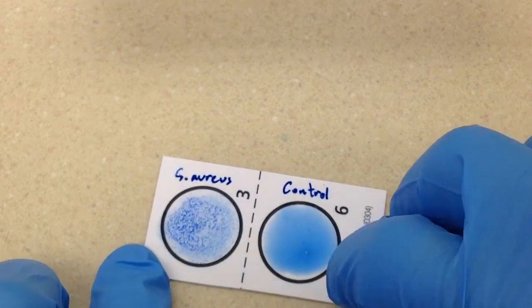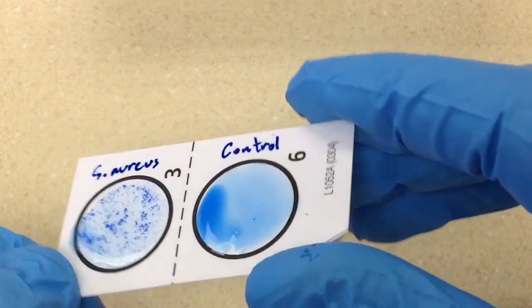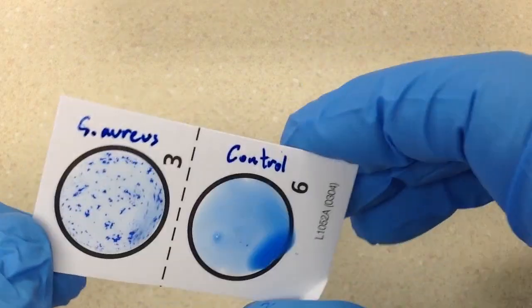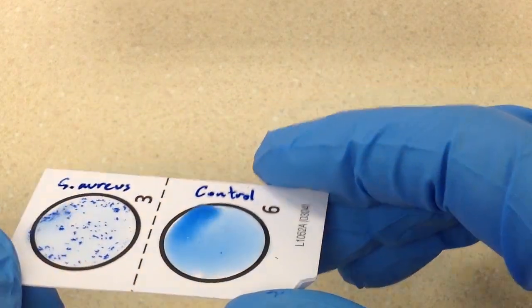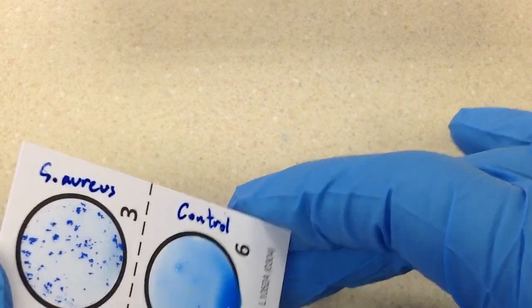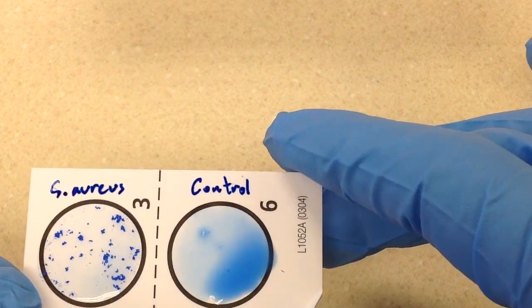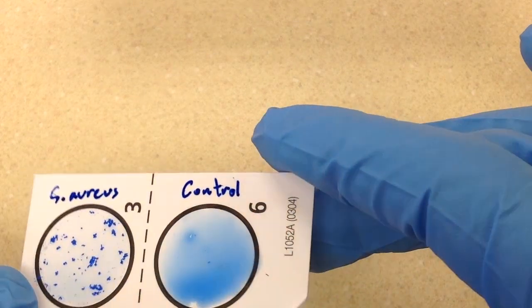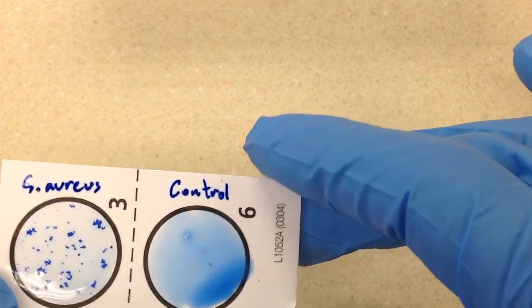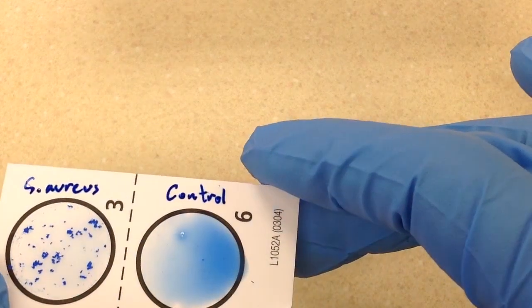Per the procedure, we're going to rotate this for 20 seconds and then read it at 20 seconds. We can see that the left circle is already looking strongly positive. The procedure says to observe and make a decision at 20 seconds — that's what you do. You don't keep rocking and say maybe if I rock it more it'll become positive. So, 20 seconds has passed and this is very clear-cut.